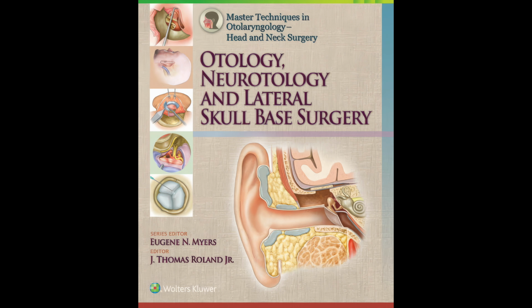We designed this technique specifically to address the largest CP angle tumors by combining a translabyrinthine approach with a subtotal petrosectomy. Together, these provide the widest possible angle of exposure and the most complete visualization of the cerebellopontine angle. Because these operations are long and complex, we often divide them into two stages, the approach and then the tumor removal.